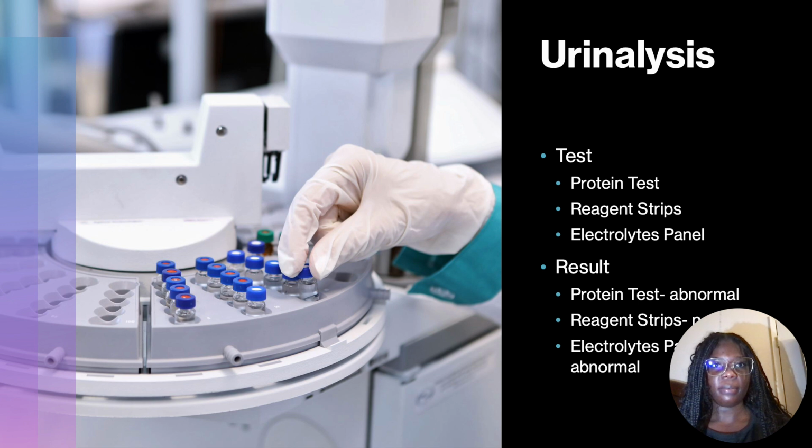The next step, rather than using a urinometer and cylinder apparatus to measure specific gravity, the lab had reagent strips that also assessed pH at the same time. So a small portion of the urine sample was applied.